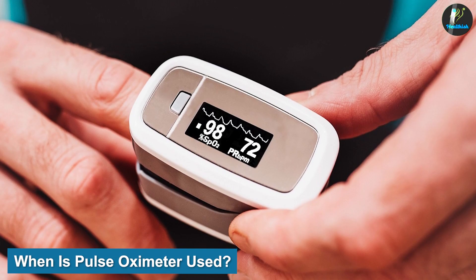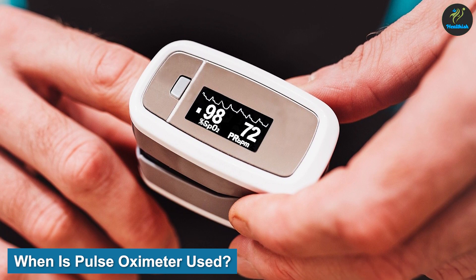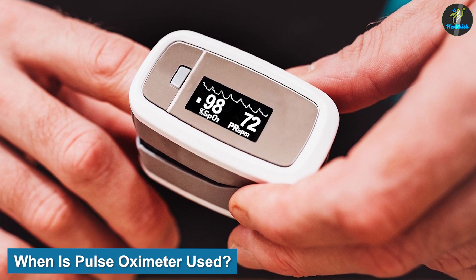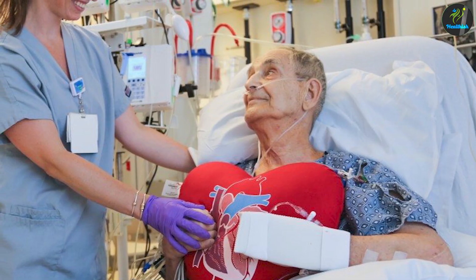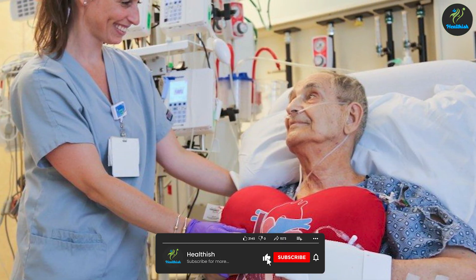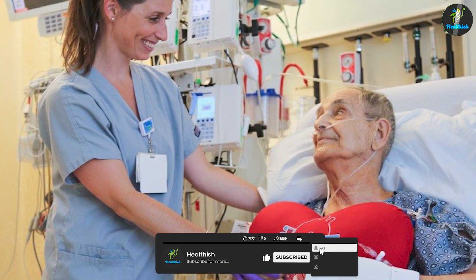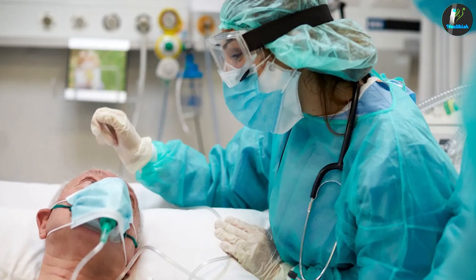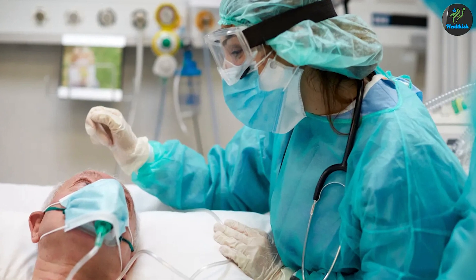Pulse oximeter is often used to monitor the oxygen saturation and heart rate of patients with respiratory or cardiac conditions, such as asthma, chronic obstructive pulmonary disease, and congestive heart failure. It is also commonly used during surgery and in intensive care units.